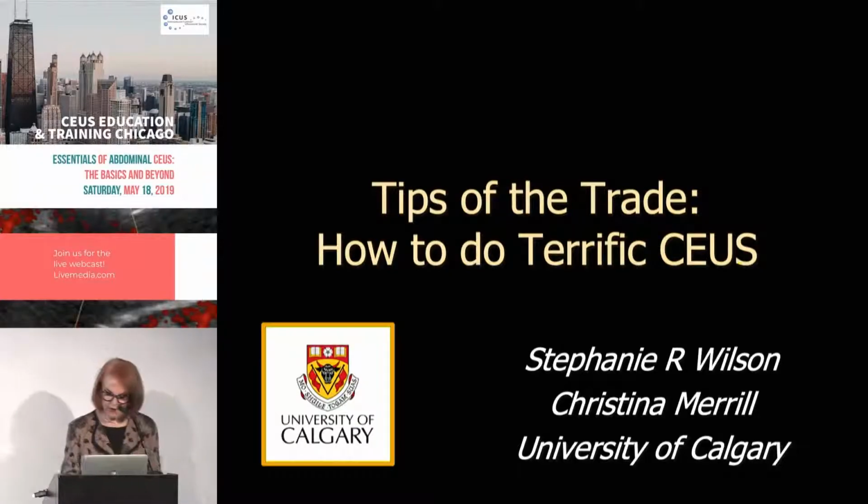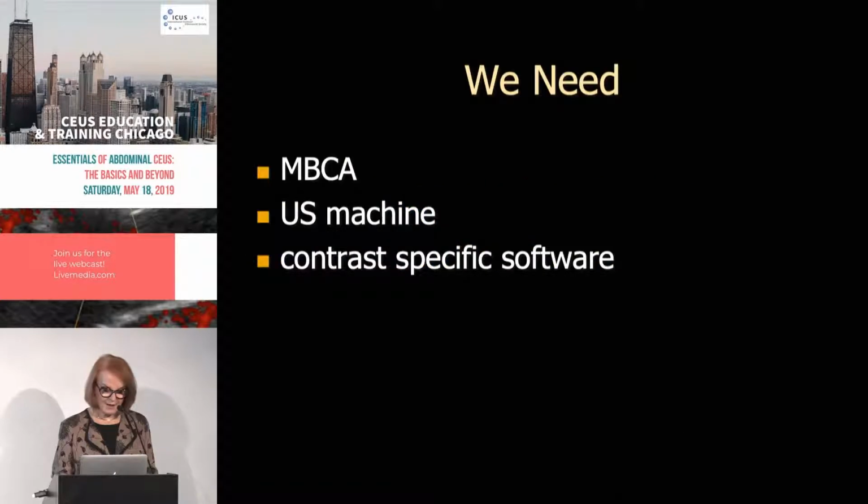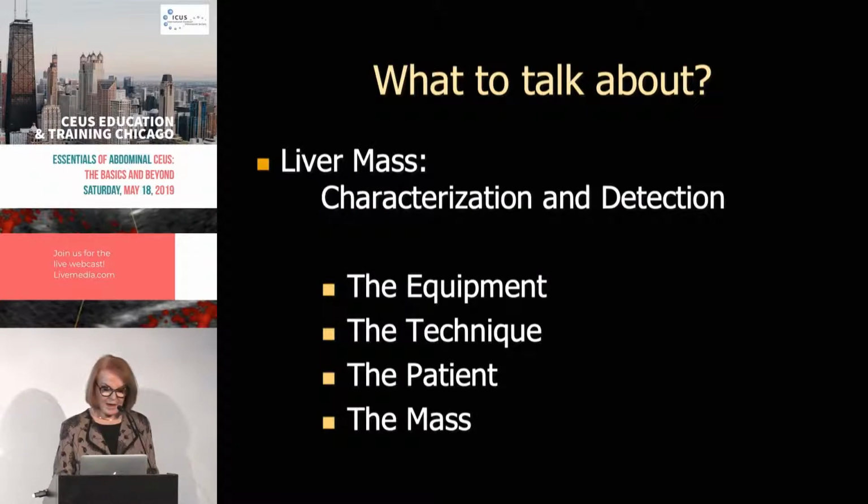So tips of the trade, how do we do terrific ultrasound? And Christina Merrill is my charge tech, who I really love a lot. So we could talk about the microbubble contrast agents, the ultrasound machine, and the contrast-specific software.